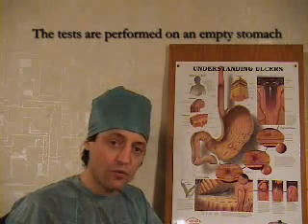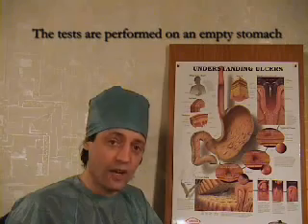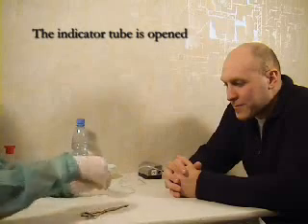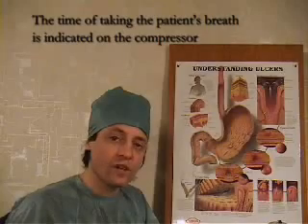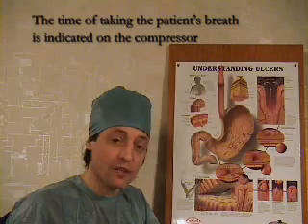Both tests are performed on an empty stomach, no less than 3 hours after the last meal. Open the indicator tube by cutting the closed ends, then connect the indicator tube to the hose of the microcompressor. Place the indicator tube in the patient's mouth so that it does not touch either the tongue or palate. Switch on the microcompressor and take the breath sample for the time period indicated on the compressor.